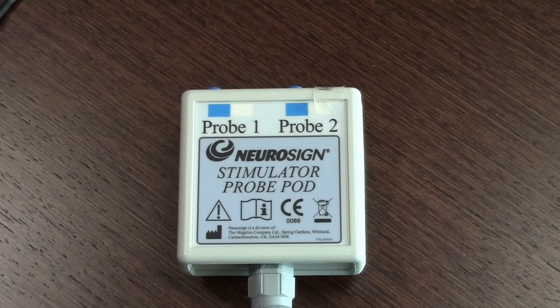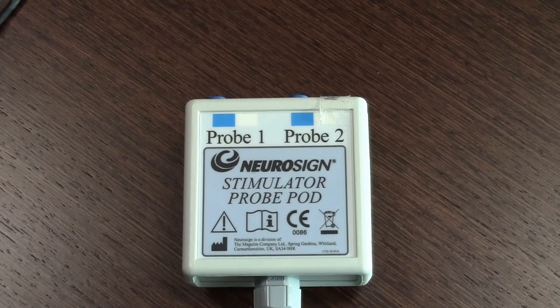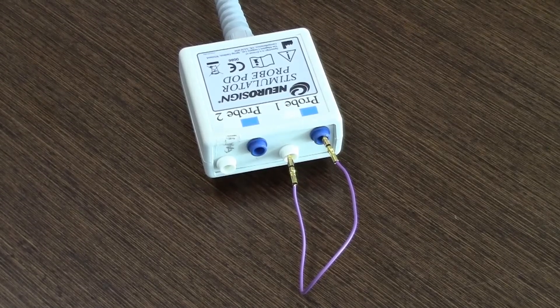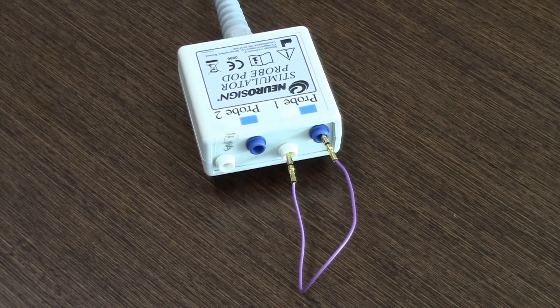The stimulating pod allows you to connect two probes — there is probe 1 and probe 2. To test the stimulating pod, take a piece of wire or a small pair of scissors and short out the blue and white on probe 1.